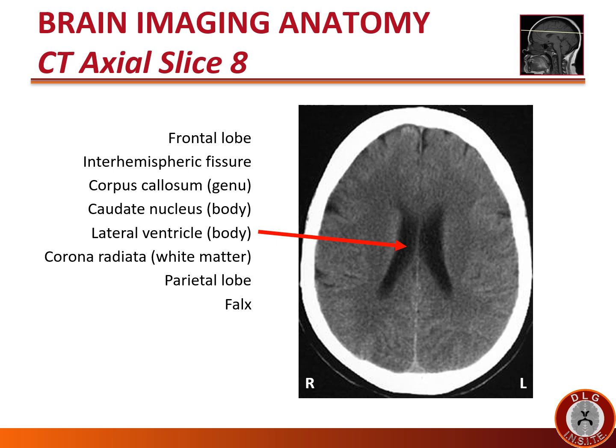We are now at the top of the lateral ventricle bodies. As long as we still see the bodies of the lateral ventricle, the deep white matter is called the corona radiata. At this level the posterior part of the brain is the parietal lobe — we are now too rostral to see the occipital lobe. Once again we see the hyperdense dural falx separating the two cerebral hemispheres.